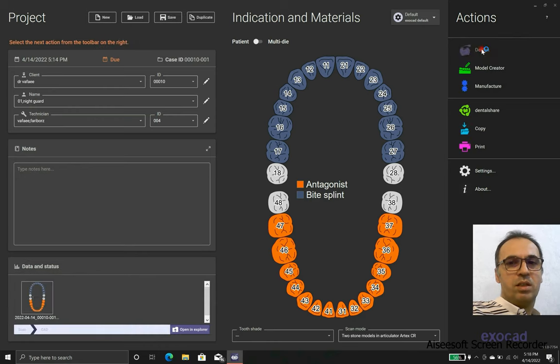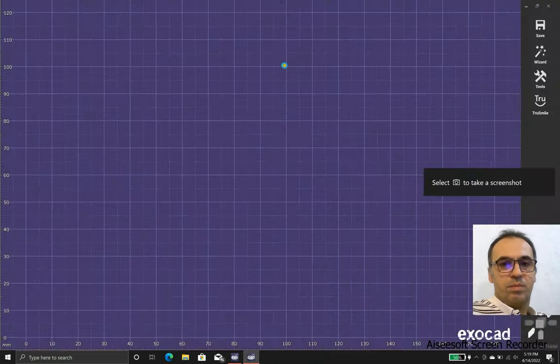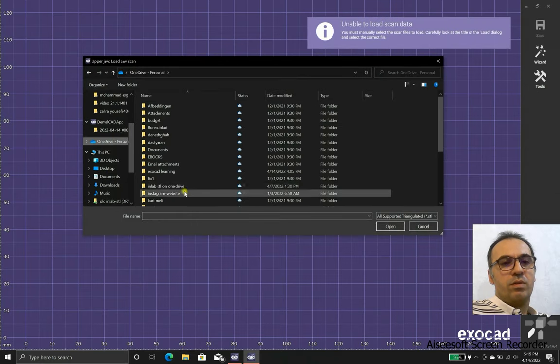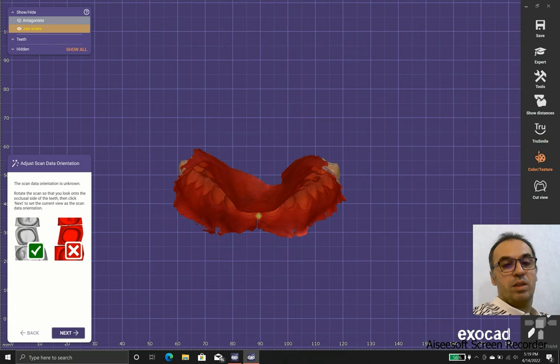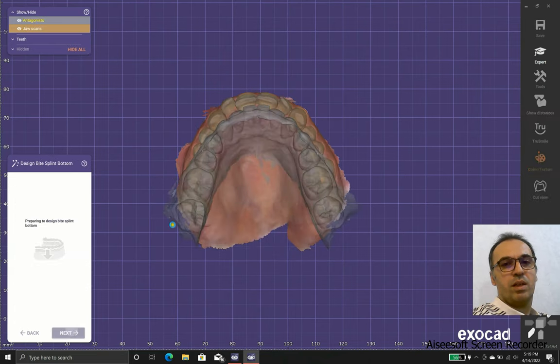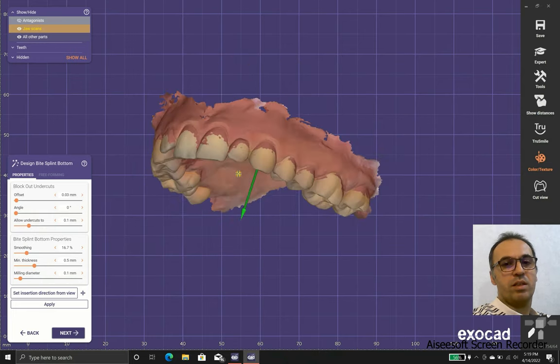Okay, we are going to design. For this particular case, we need two scans: one for the upper jaw and one for the lower jaw. In case you use PLY format, you can have the colors as they were scanned in the mouth.